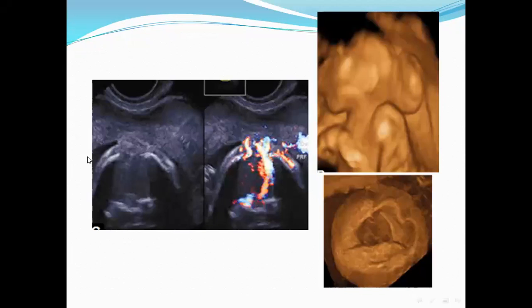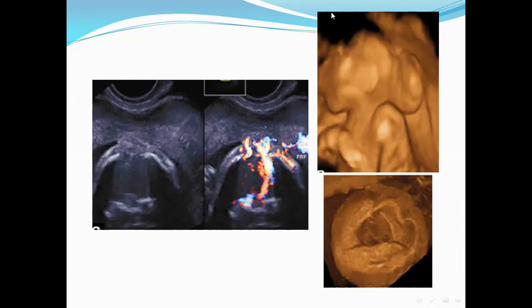This is another picture of encephalocele documented by Doppler, showing the connection between the intracranial structure and extracranial structure. This is a more obvious picture by 3D, showing the effect of encephalocele and the effect on the skull bone.